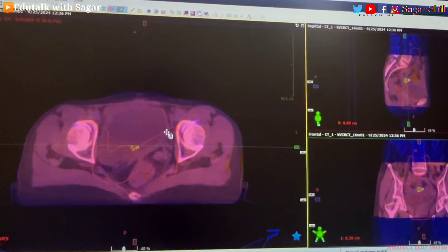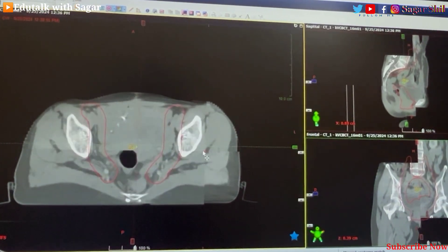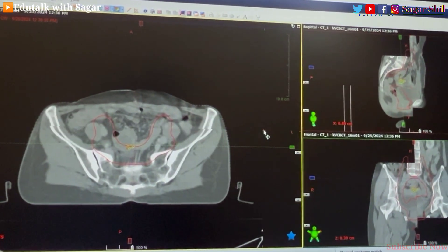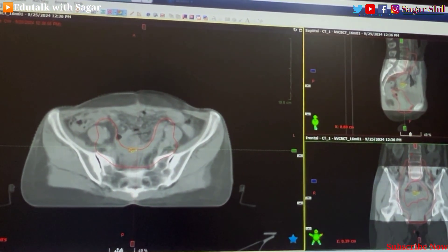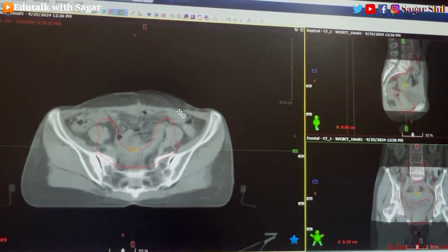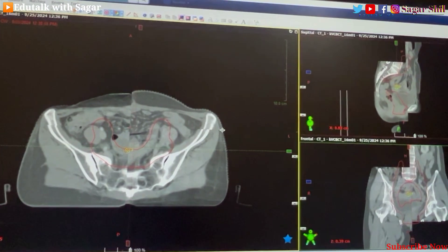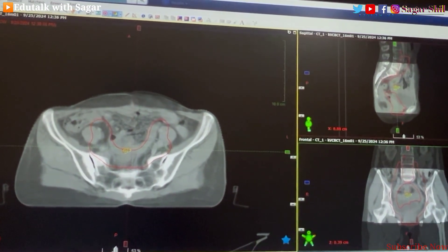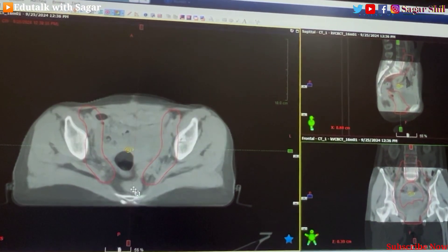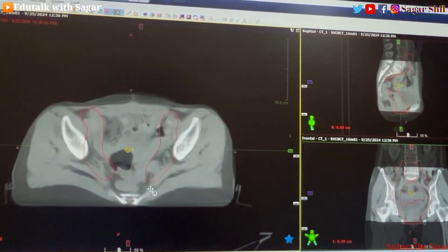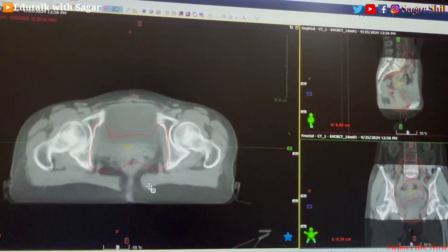We have a lot of split window and coloring view options also. With the help of these many features it's not a very big thing — don't think that matching CBCT images is very difficult. Here you can see there is roll rotation — you can see the roll. If this variation is very high, you should reposition the patient, or you can take an average. Keep in mind the OARs should be in a safe dose.